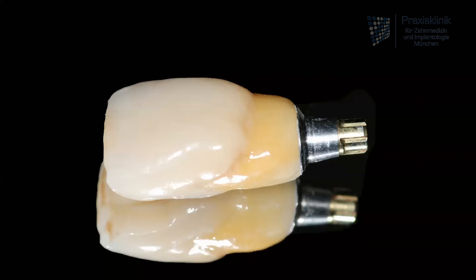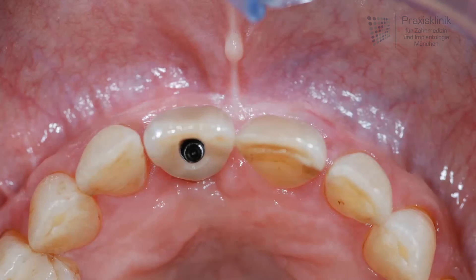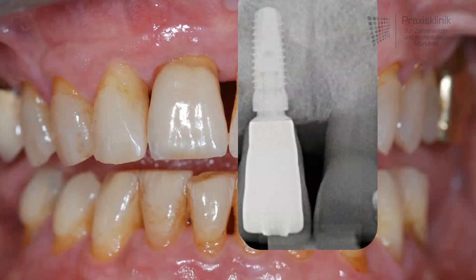The definitive restoration is a screwed single crown made of ceramic. In this picture we see in the top view the screw access hole on the palatal side of the crown. This will be covered by a composite resin and after polishing it is clearly invisible. In this x-ray image we can see the sufficient position of the implant and very healthy bone around the implant.